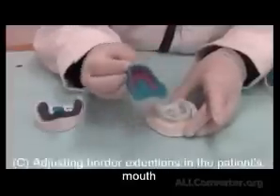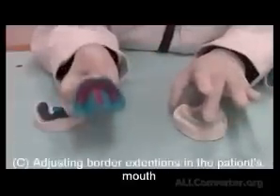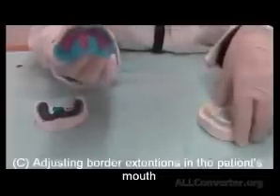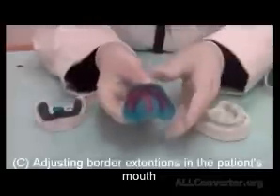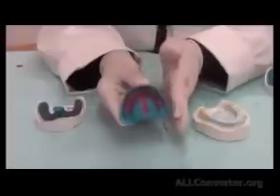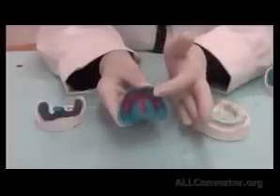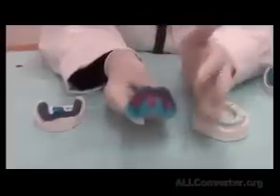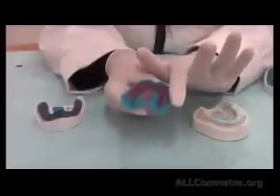I go back and check the tray inside the patient's mouth, because sometimes on the cast they look beautiful, but once inside the patient's mouth, some patients have hyperactive tissue. That means their tissue can move a lot around the denture area. So those people that have a lot of function around the denture border area, we might find that once inserting this inside the patient's mouth, it might be hitting the sulcus rather than being 2 millimeters away from it.